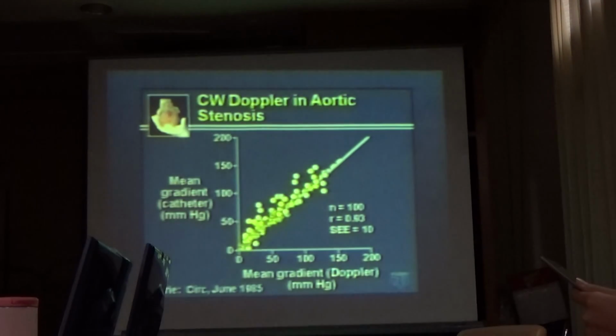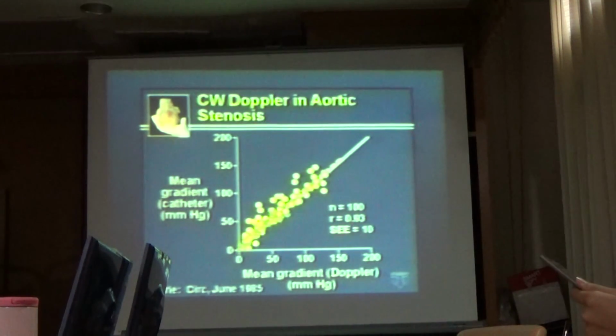In the correlation study published by Dr. Curry from June 1985, showed excellent correlation between the Doppler-derived mean gradient and catheter-derived mean gradients.